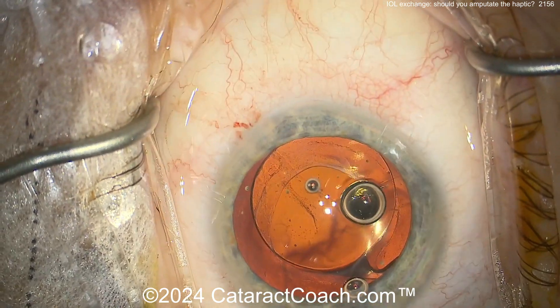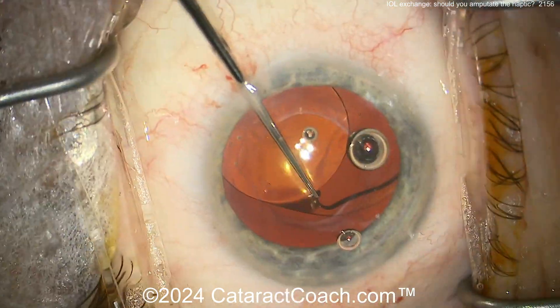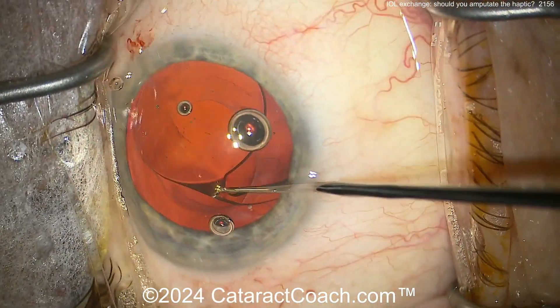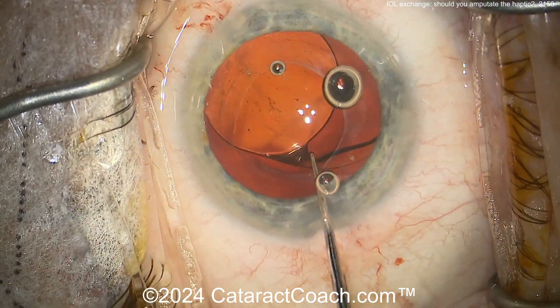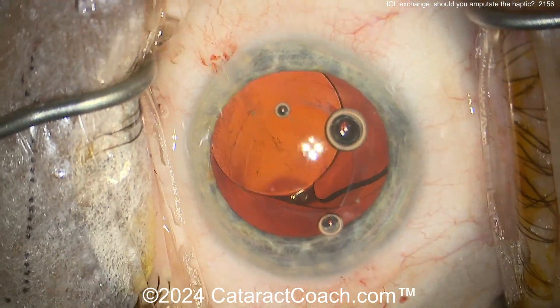Here's more visco dissection. You can see that green — looks like it's Provisc. I tend to use a dispersive agent. You can see you can free up the lens, but the haptic is still stuck there. Both haptics are very much stuck at the edge of the haptic where it touches the lens capsular bag equator.